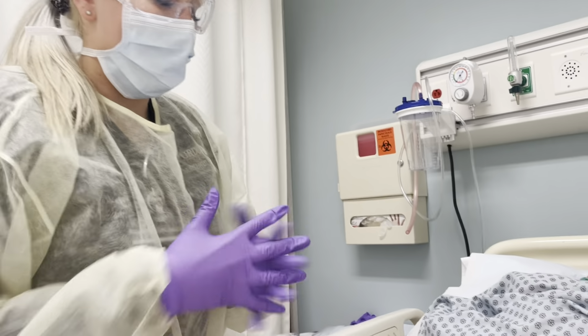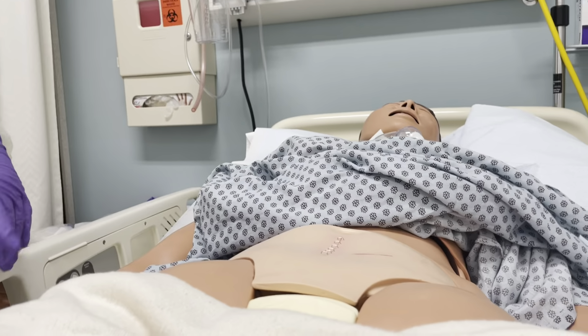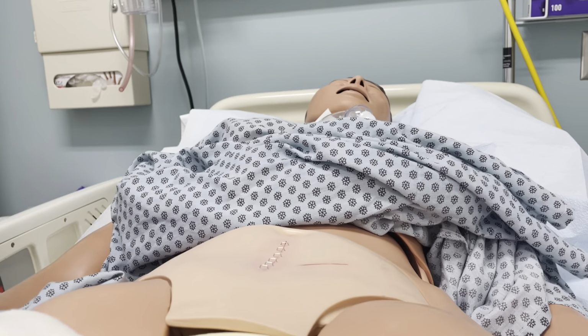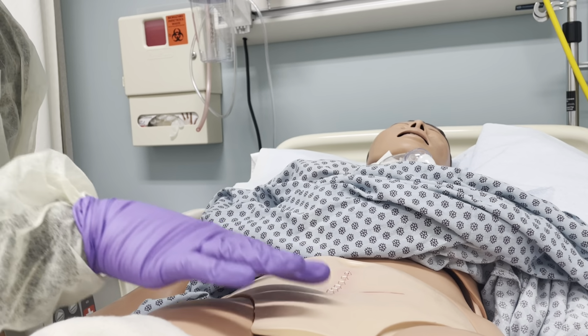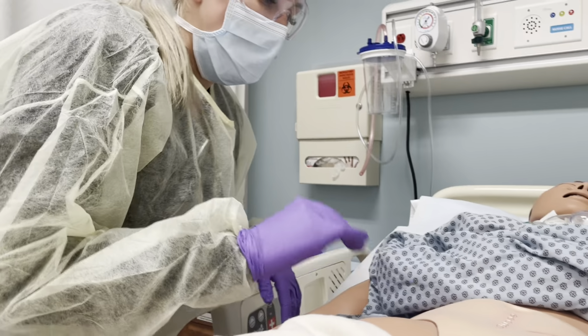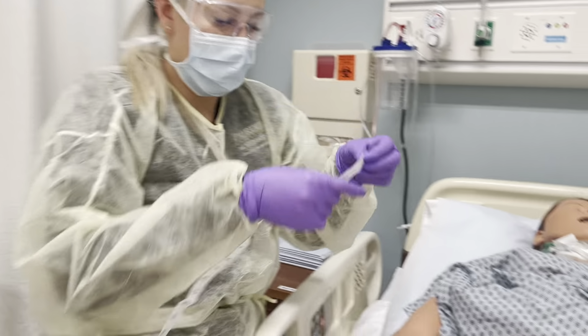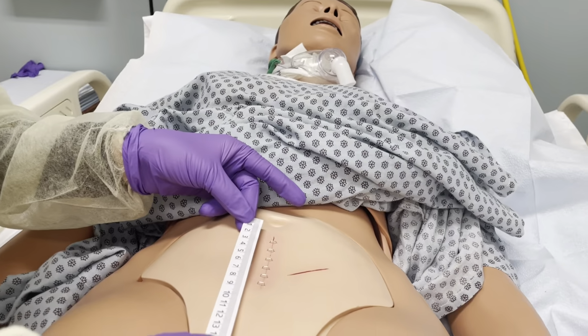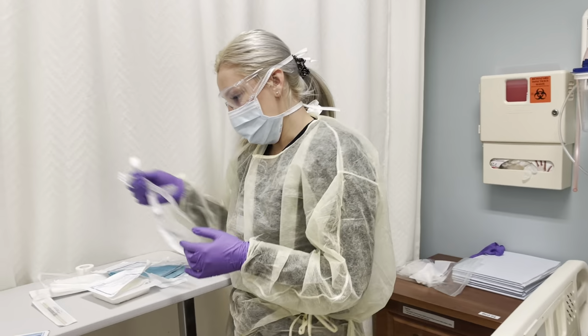I'm now going to be inspecting the wound itself, so I'm looking for any drainage, erythema, edema, swelling, or bruising. None of that is present other than the erythema. Staples are used for the wound. Now I'm going to measure. Wound is 8 centimeters long and 1 centimeter wide, and depth is not necessary for this wound.